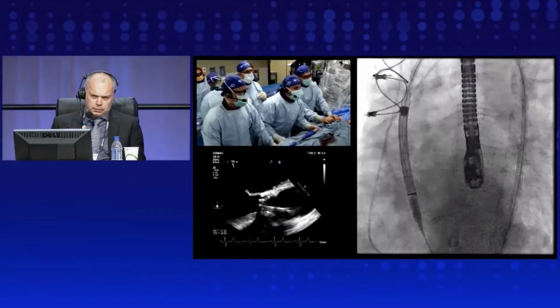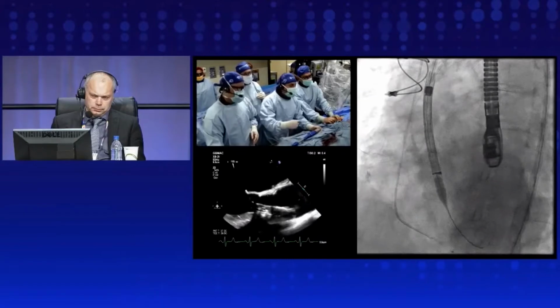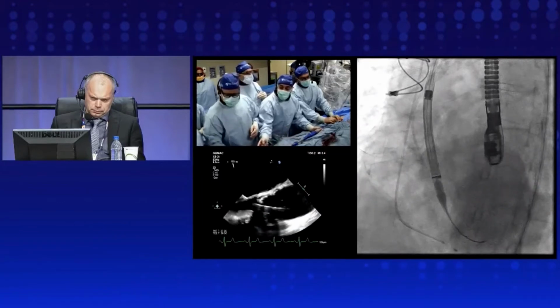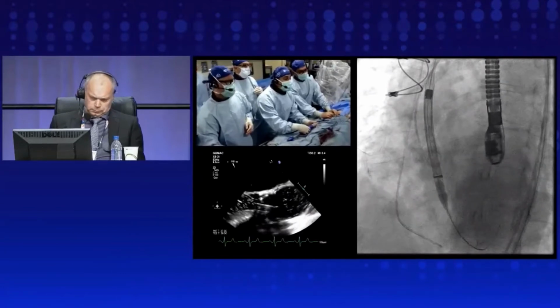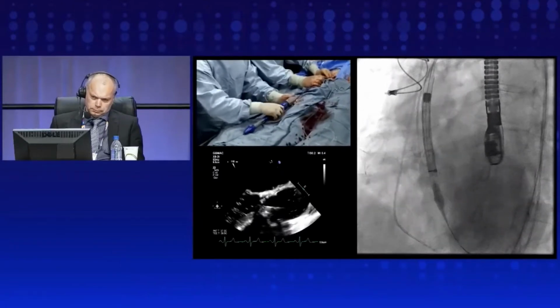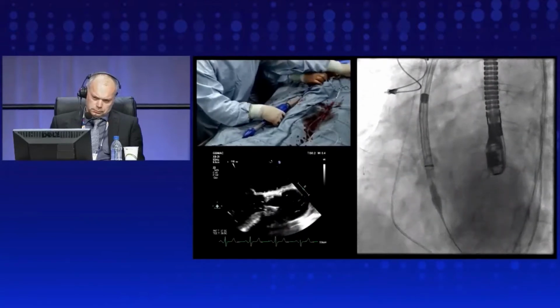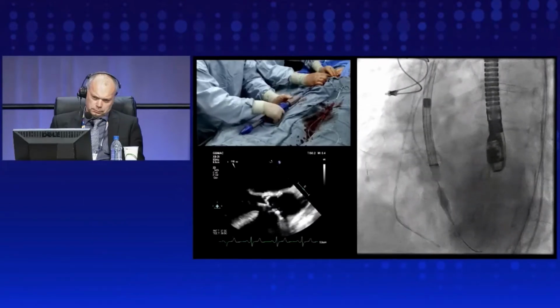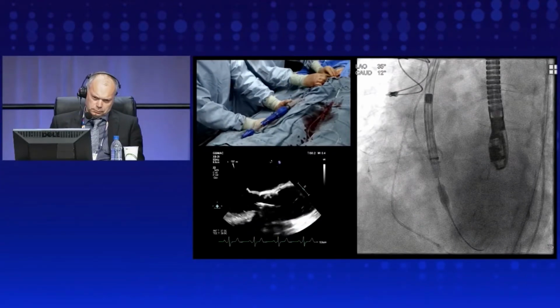We'll focus on the implant here, so our aim is not to be too high. It's counterintuitive for valve-in-valve cases, but this is a stentless valve-in-valve, so it will be a bit deeper than that. Can you inject? So we're going to try to implant this, and I think we're shooting for about 8 millimeters below, Danny. So we don't want the skirt to also obstruct the Basilica tear, the gap. It's good. Small injection, please. So in this case, I think TE is going to be very helpful with implant height. Having a repositionable device is also quite important.